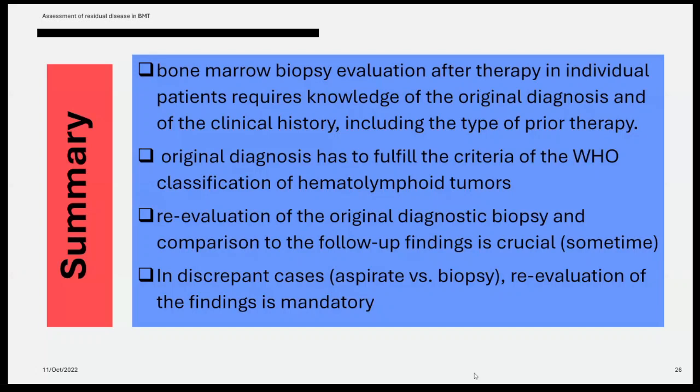because why we are addressing the intensity, because we learn from angioimmunoblastic T-cell lymphoma, the PD1 has to be dark brown, because the T cells surrounding, the interfollicular T cells, will also be PD1 positive, and we grade them as mild to moderate only. So if they are moderate and the lymphoma cells are also moderate, we cannot call it angioimmunoblastic T-cell lymphoma. It has to be dark brown staining.